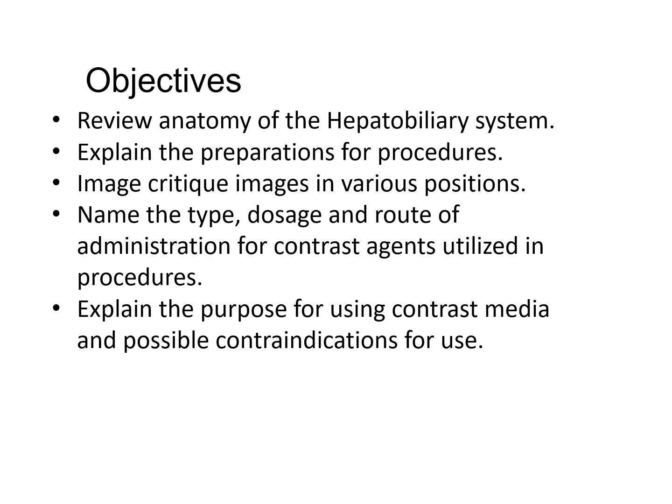Type, dosage, and route of administration for contrast agents: route of administration is what varies the most. The type and the dose is pretty standard, usually on the order of 10 to 20 cc's of non-ionic iodinated contrast.